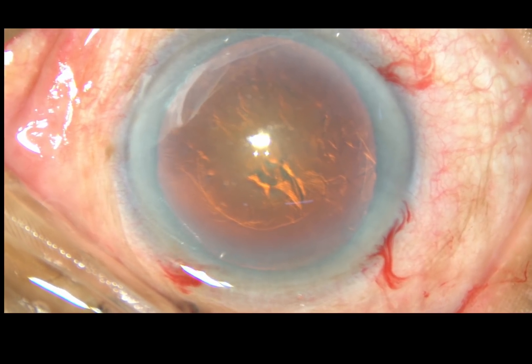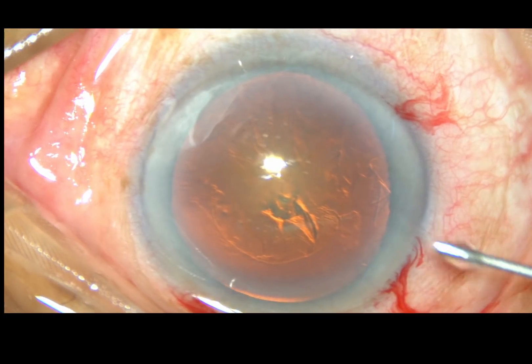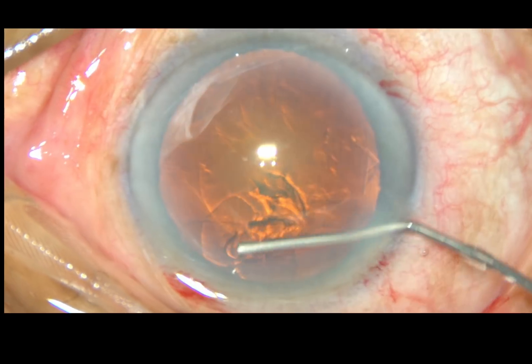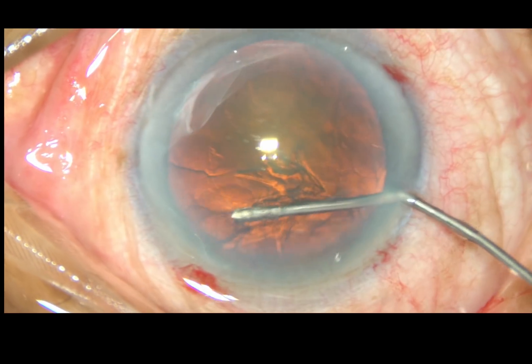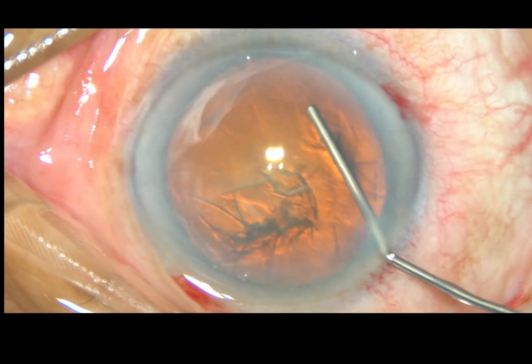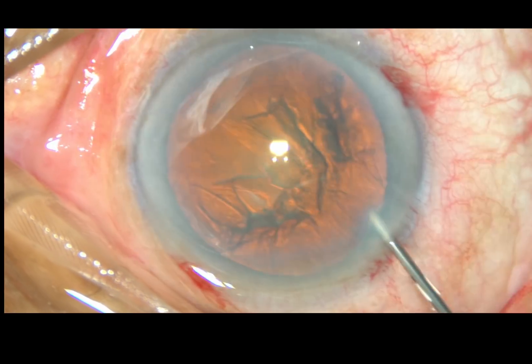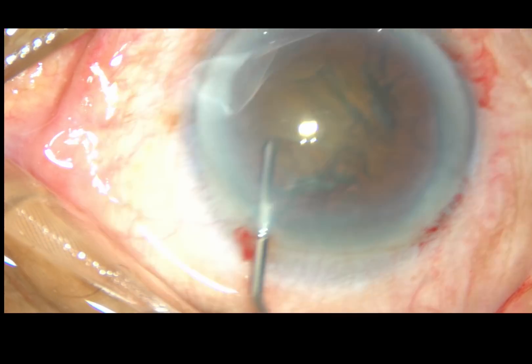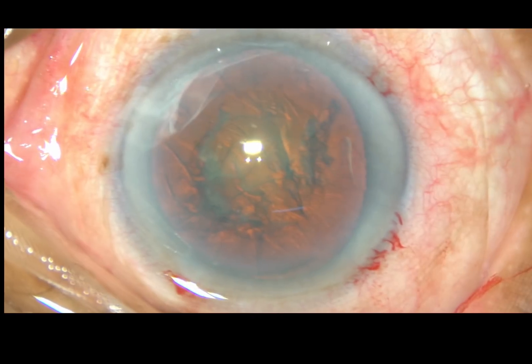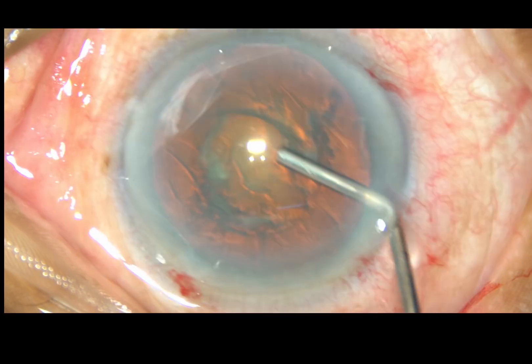Now hydrodissection. This is a 27 gauge cannula. BSS is first injected underneath the anterior capsular rim. The fluid wave goes to the opposite side. The nucleus — the cataract — is tapped and the nucleus is rotated. And now some more viscoelastic is added.